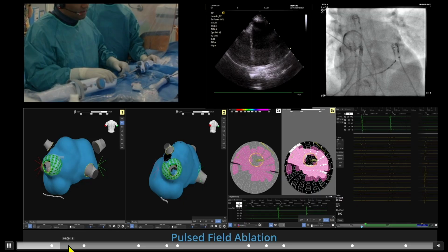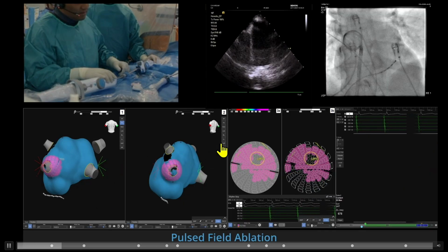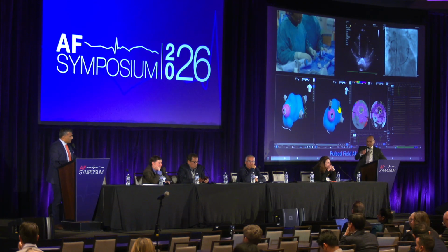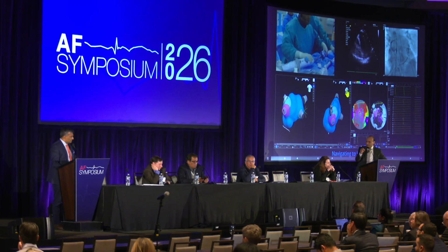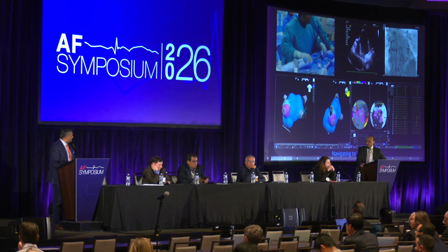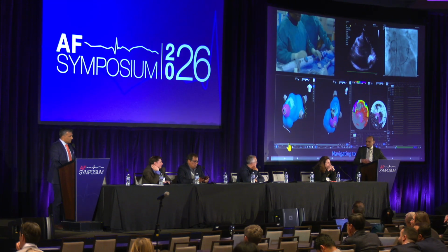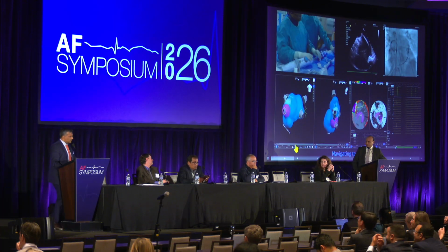Vivek, can we pause for a second? Yeah. I'm just going to let this run because I actually want to focus on something else. This is a catheter that allows mapping, contact sensing, selective electrode ablation. Andre, where do you think this will fit in what we have now? What does it add? Is there any unmet need that this catheter would fill?